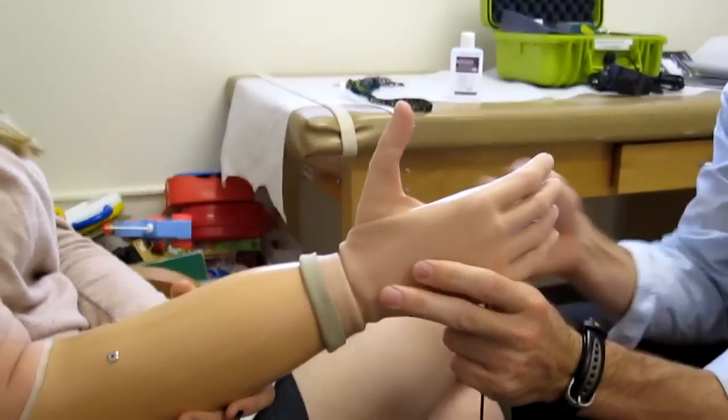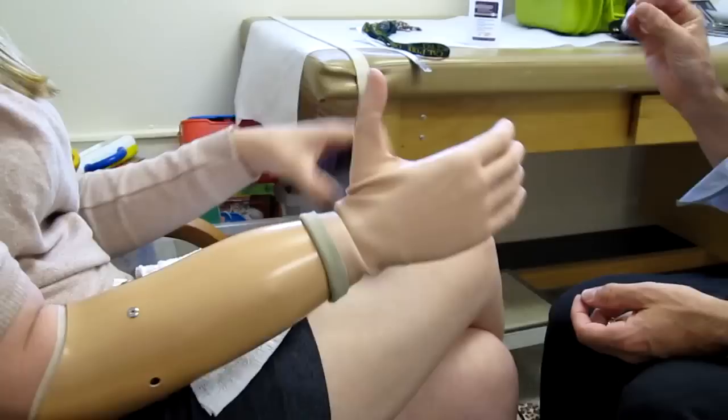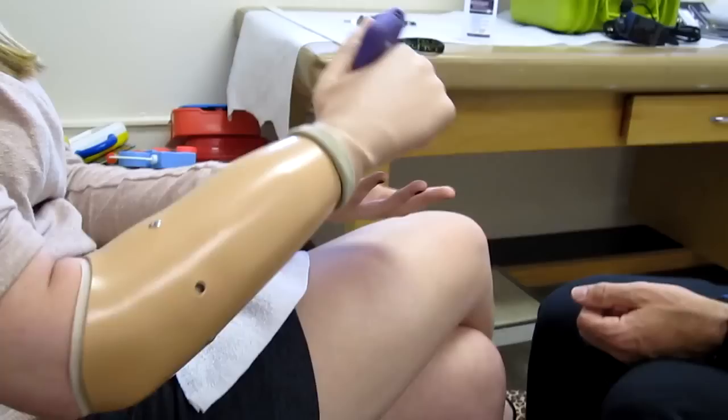It's just a hinge. So if you wanted to hold papers, instead of holding it like this, you could... Yep. Oh, okay.